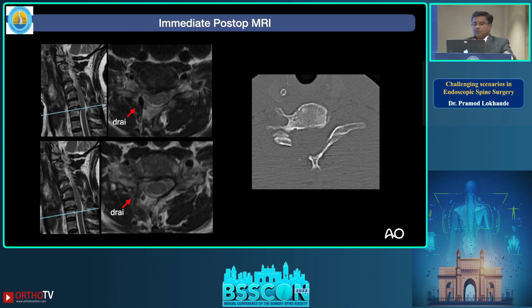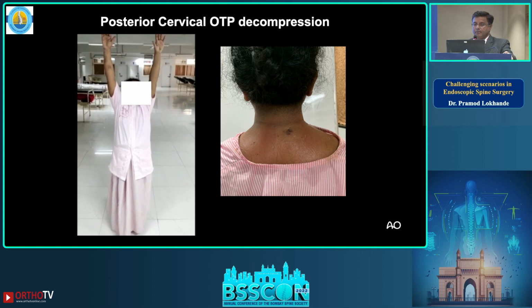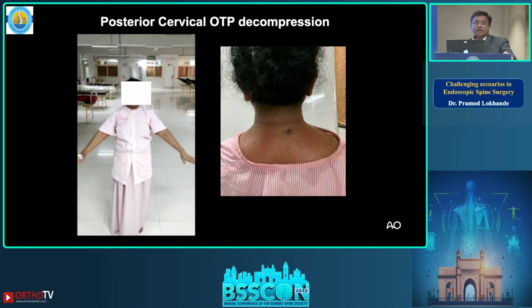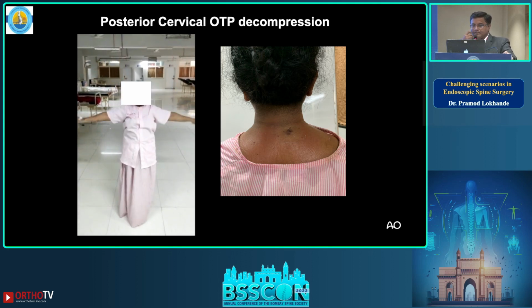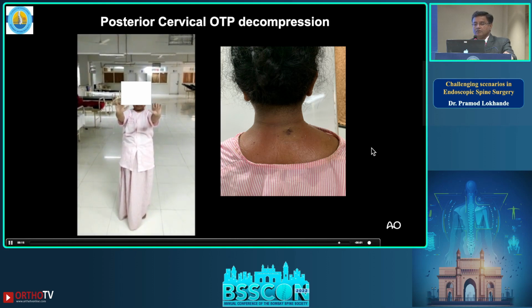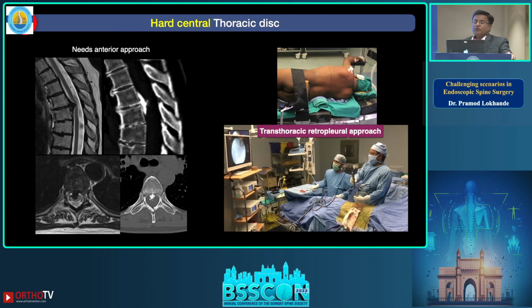So these are the post-operative MRI pictures, and the patient mobilized the same evening. There you can see on the right hand, she has got a burn which she was absolutely not feeling. Her sensations returned after a couple of months, and she is still completely painless after almost 2.5 years of follow-up. Another case scenario, a central hard disc in the thoracic spine.